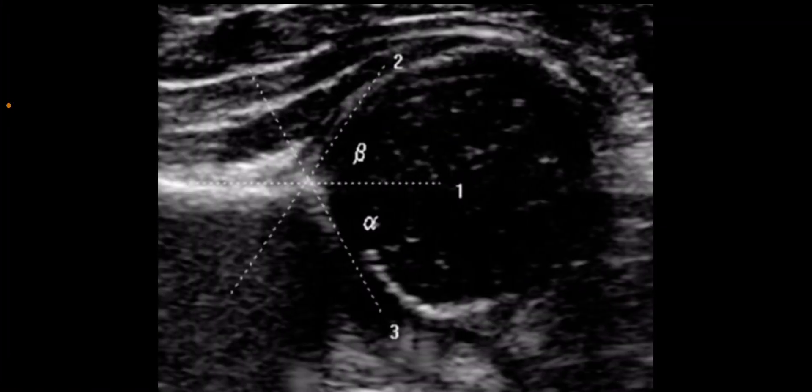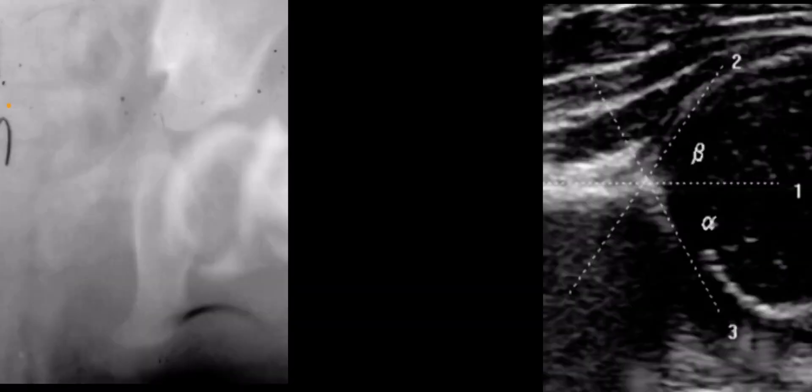In the older infant with DDH, the labrum may be inverted and may mechanically block concentric reduction of the hip. Inverted limbus represents a pathologic response of the acetabulum to abnormal pressures caused by superior migration of the femoral head, consisting of fibrous tissue. Hip capsule is constricted by iliopsoas tendon causing hourglass deformity of the capsule. Pulvinar: fibro-fatty tissue within the acetabulum that can act as a block to reduction.